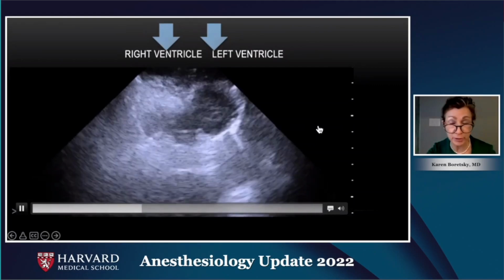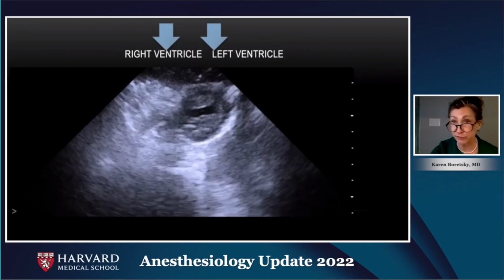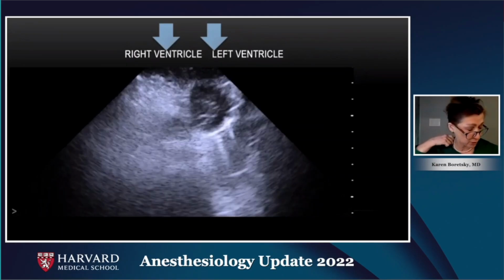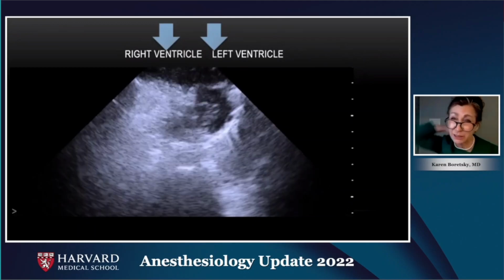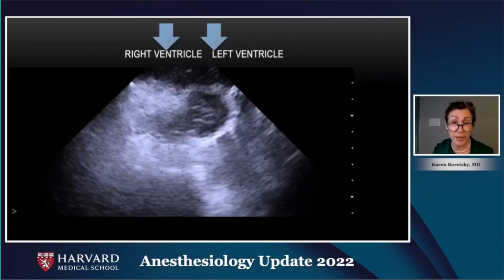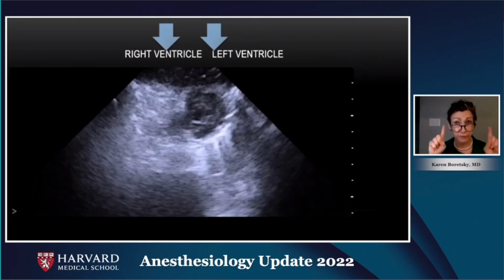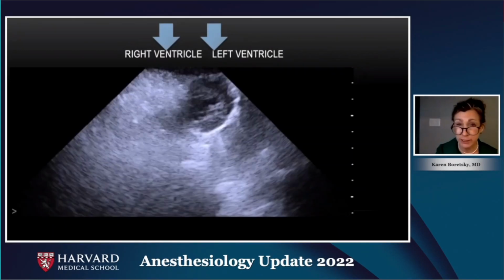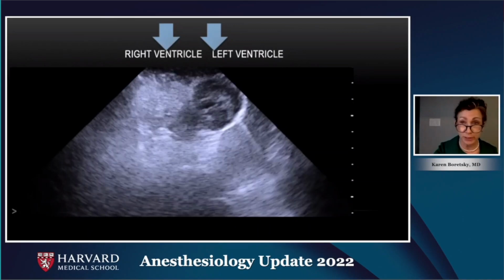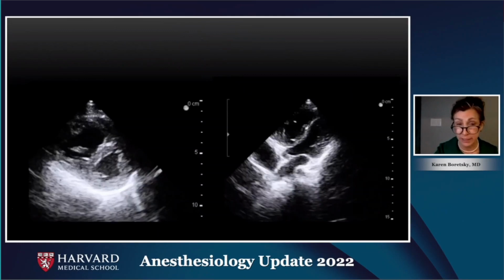What had happened was the rotating resident had started a second IV and had forgotten to flush the air out. And this small child, 7 kilos, developed a hemodynamically significant air embolus. We immediately put the child head down, gave a large bolus of non-air containing fluid, resuscitated the child, and were able to, in fact, continue with the surgery. We finished it, explained to the parents what happened, and we're just happy to have been able to make that diagnosis.